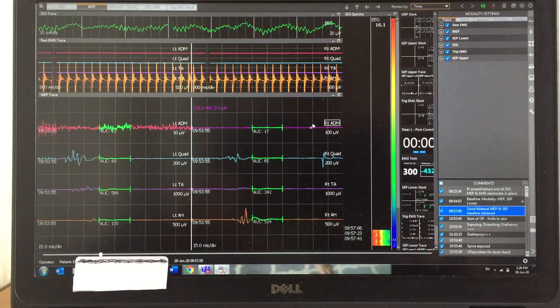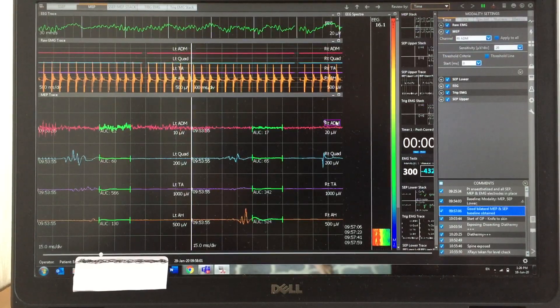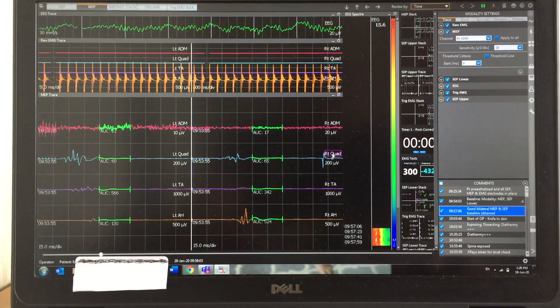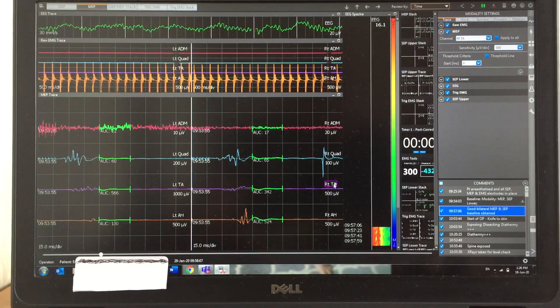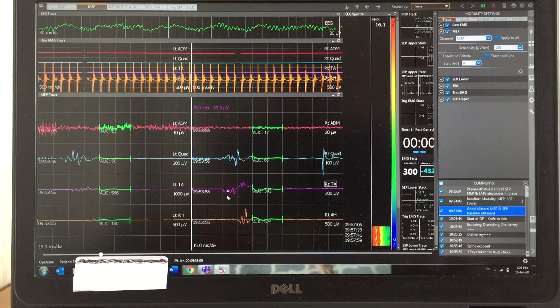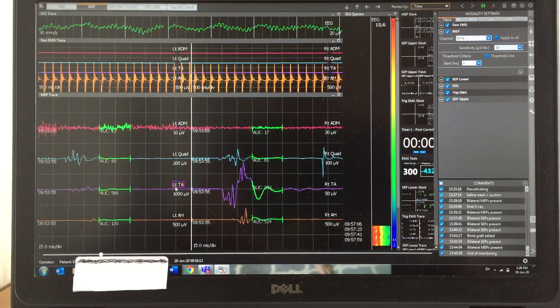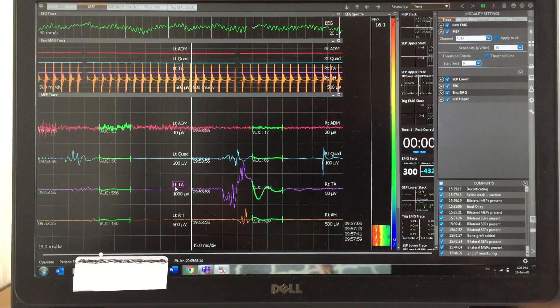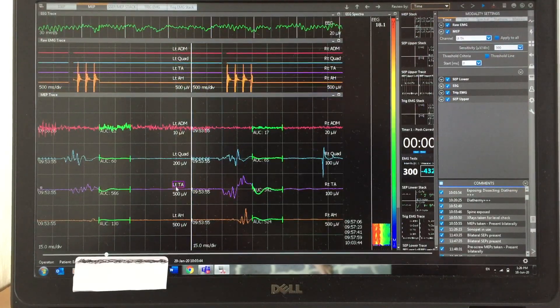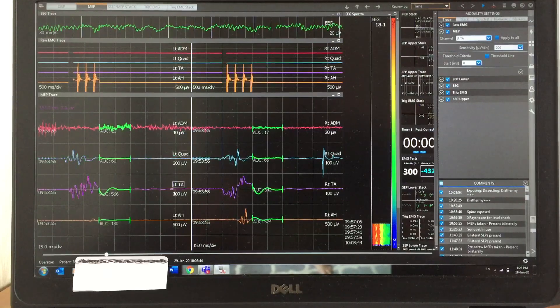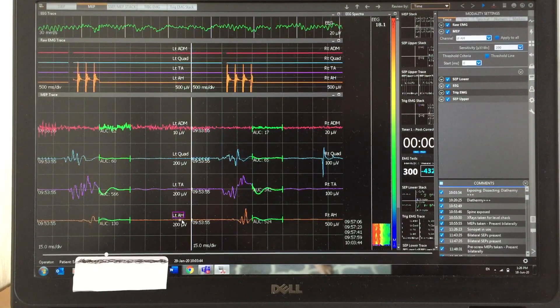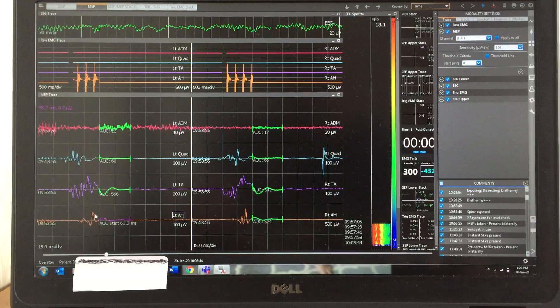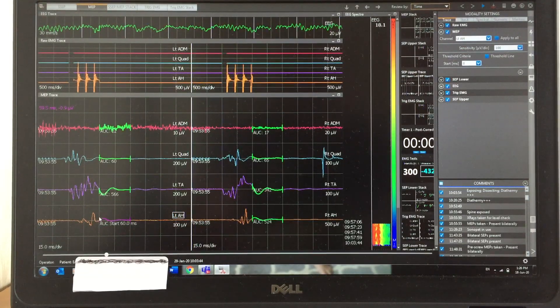I'm going to increase the sensitivity so you can see the traces clearly. When you try to establish the baseline, it may be a little bit tricky because some anesthetize with gas, and before positioning they will change from gas to TIVA.